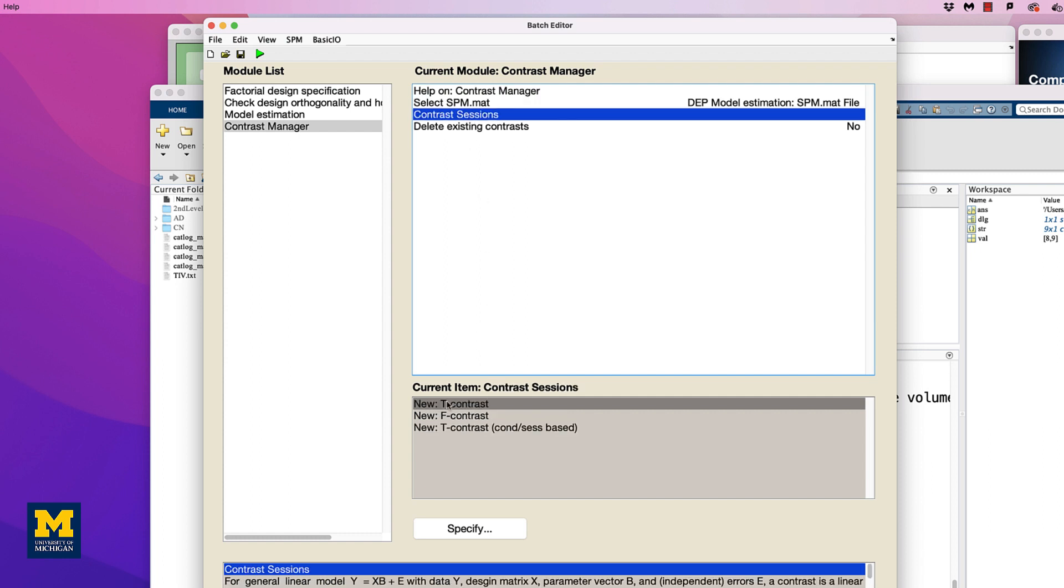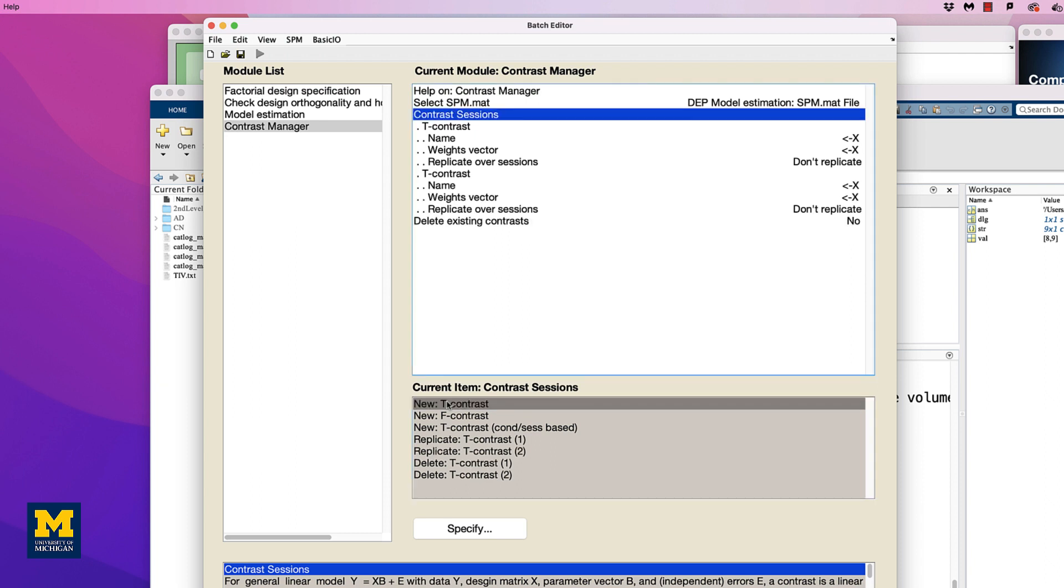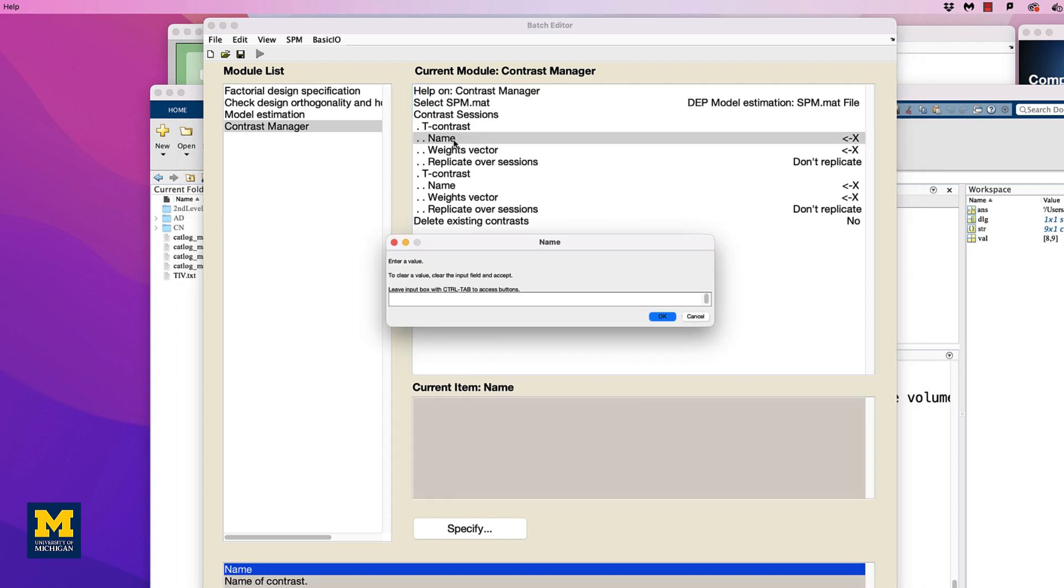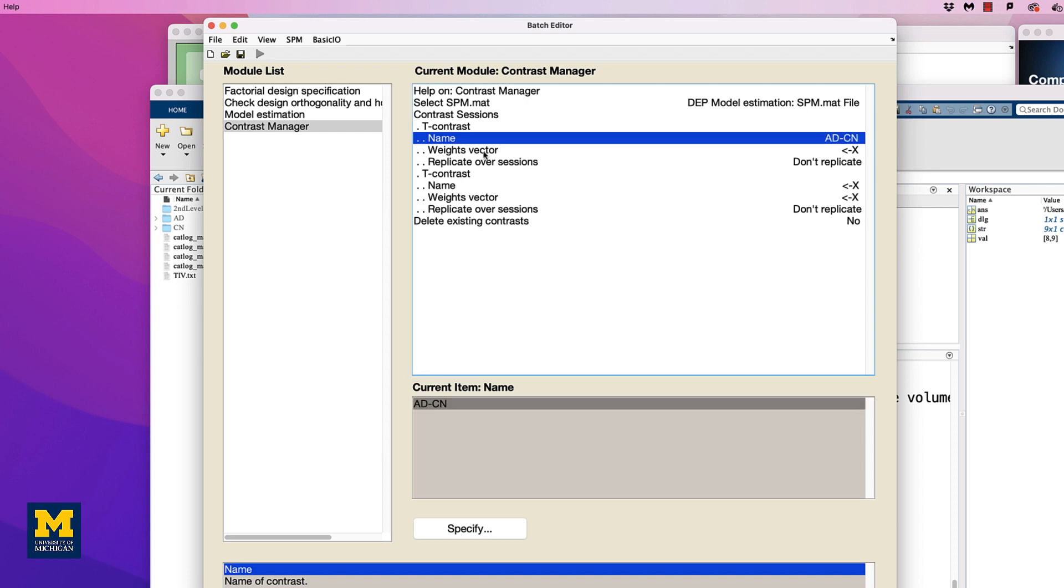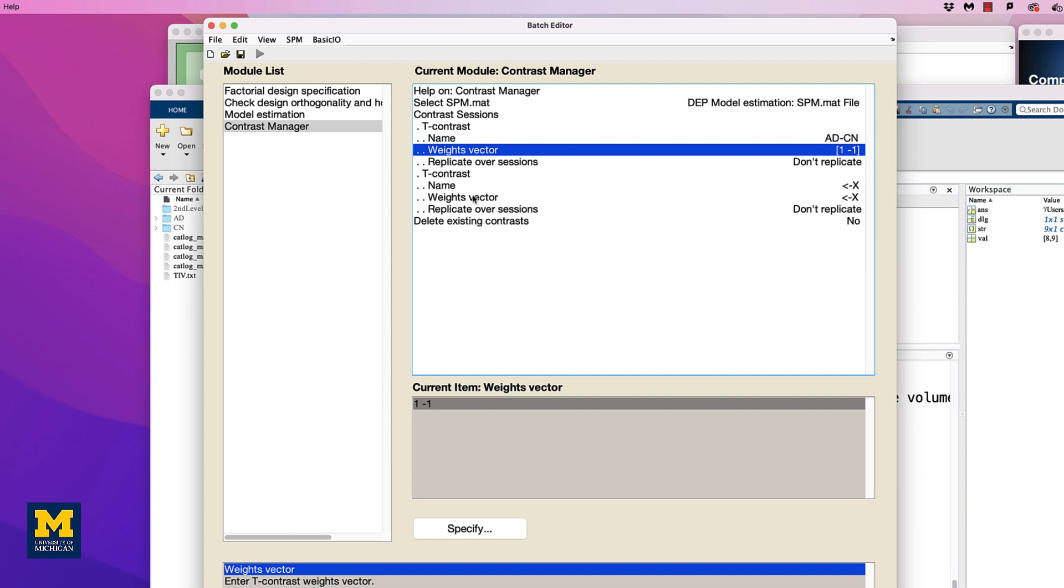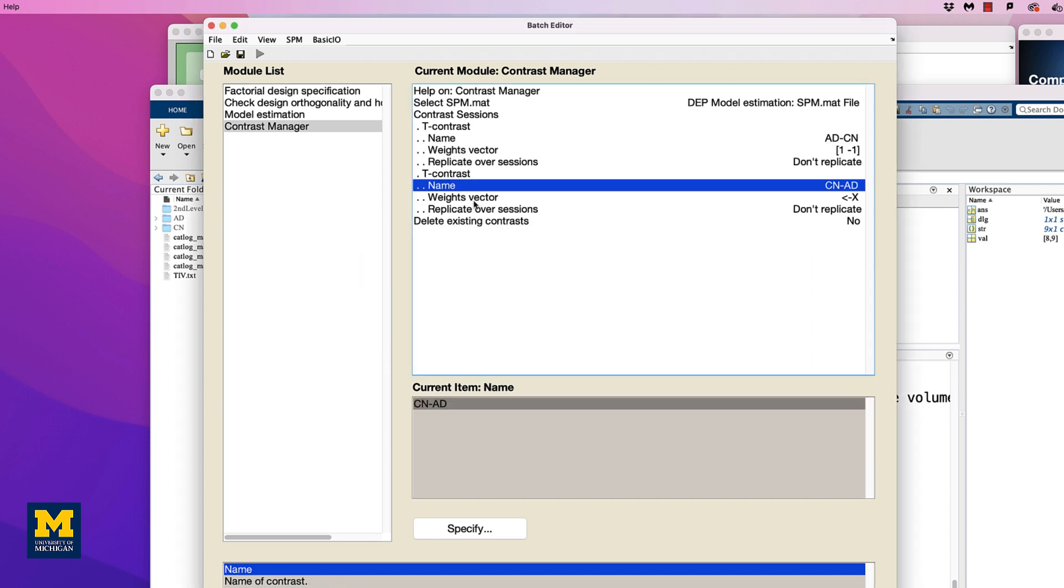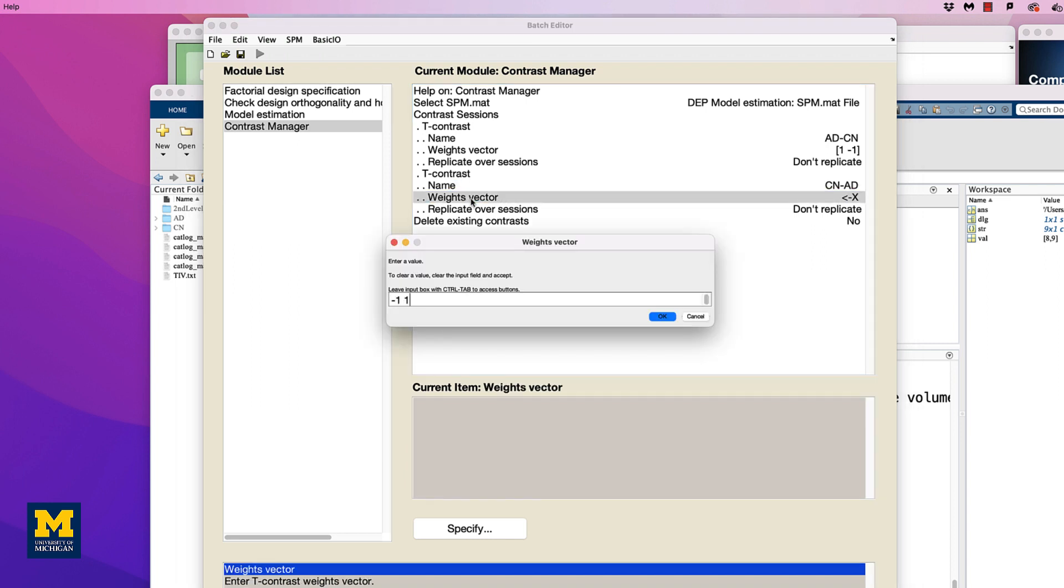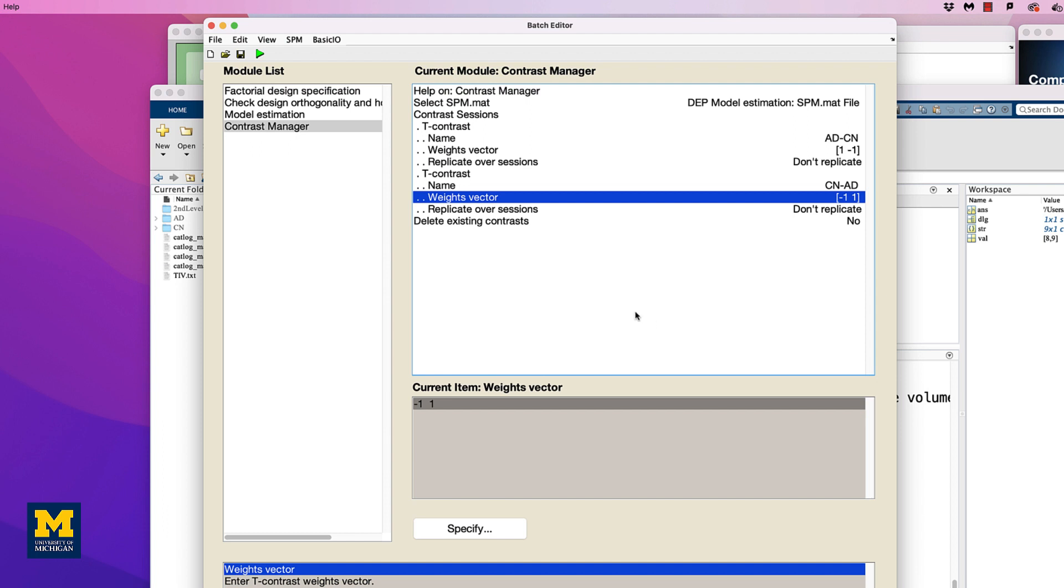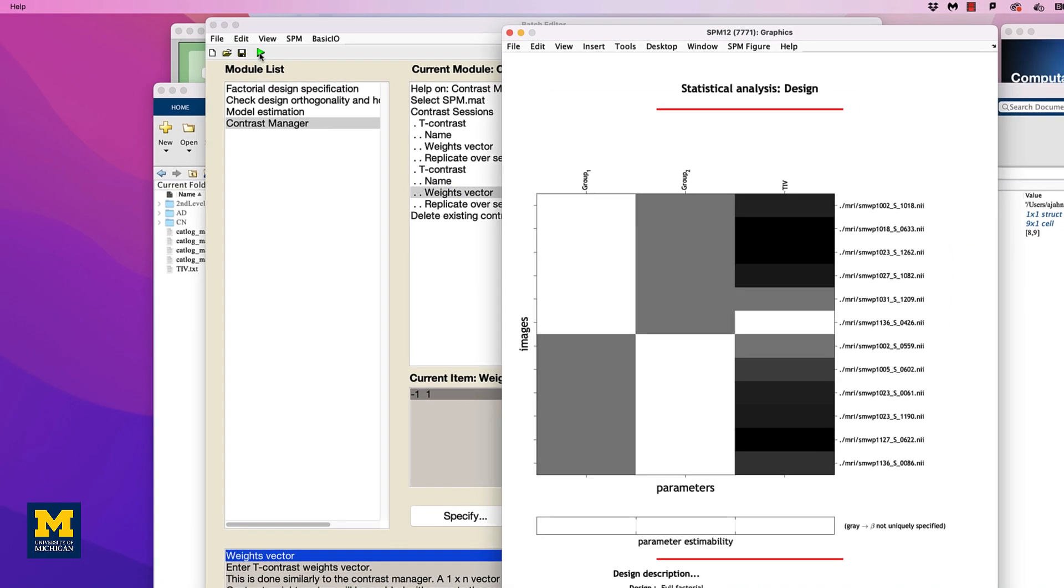Then click on Contrast Sessions, and create two new T-contrasts. Since the AD group is the first regressor in our model, and the CN group is the second regressor, the first contrast weight in our vector will correspond to the Alzheimer's group, and the second weight will correspond to the control group. For the first T contrast, therefore, change the name to AD minus CN, and the weights vector to 1-1. Likewise, for the second T contrast, change the name to CN minus AD, and give it a contrast vector of negative 1, positive 1. When you are done, the module list and the contrast manager should look like this.